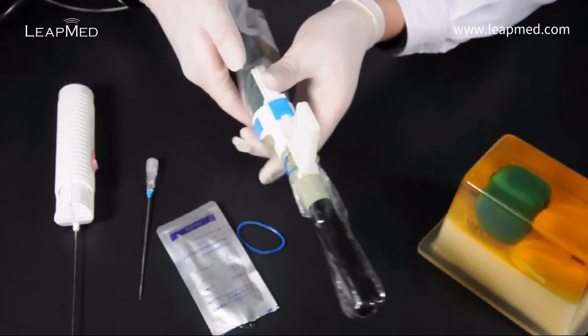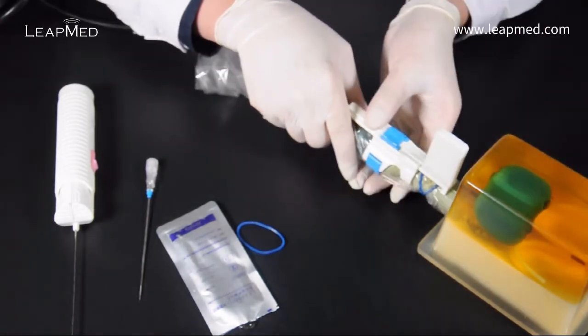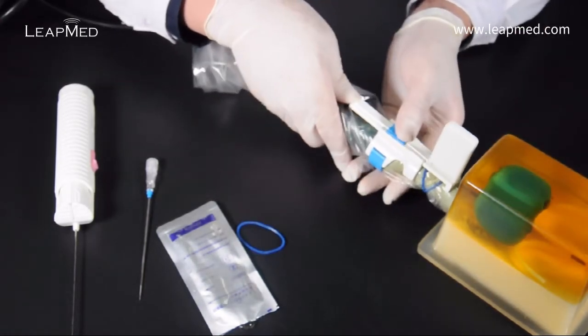Apply some gel on the top of the probe and insert the probe into the rectum slowly. When you find the right position push the needle guide forward and lock.